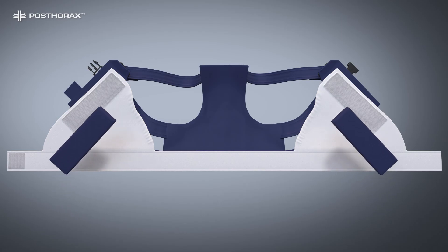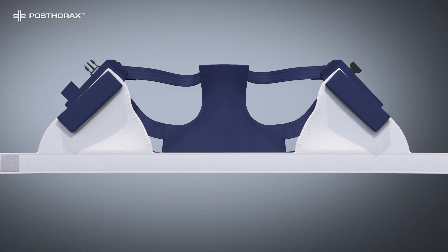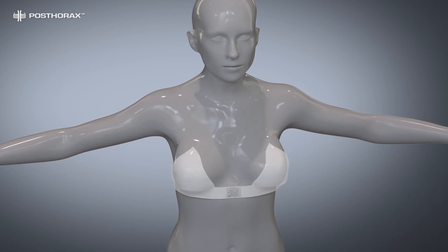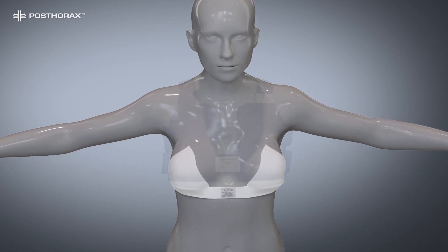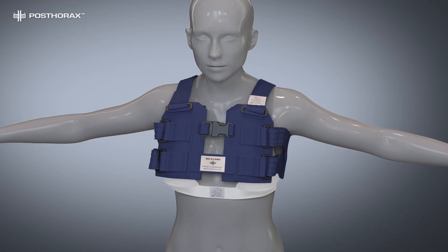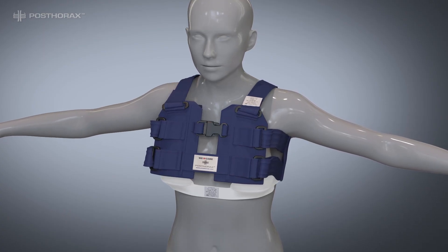The pads are then reattached, the thicker end facing the top. The support bra is now attached to the support vest between the front section and the cushions. The support bra relieves the weight from the chest wound and reduces pain. The finished combination can now be fitted to the female patient.